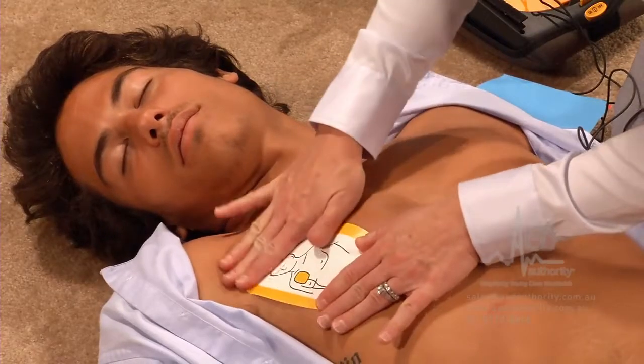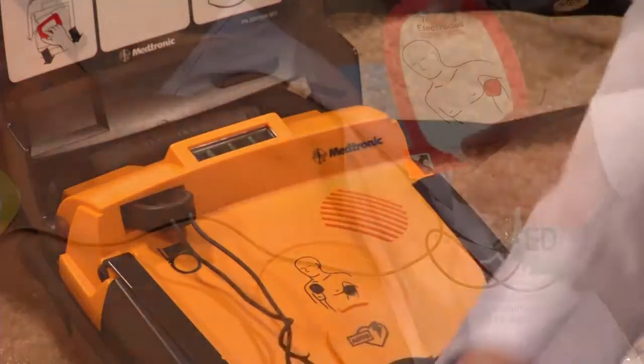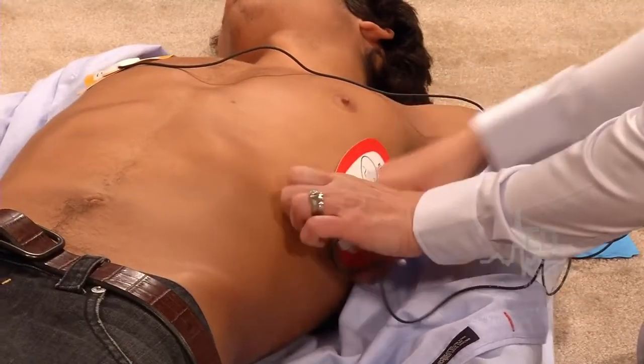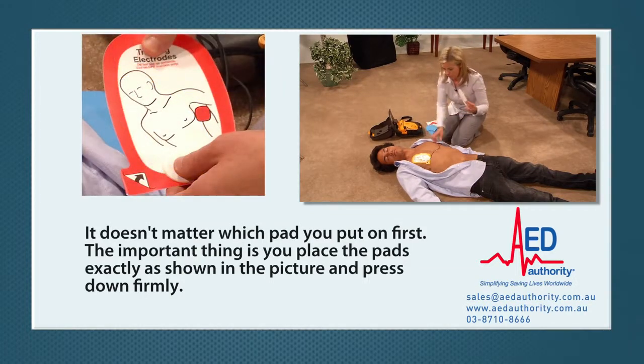Press the pad firmly. Peel the other pad off the blue plastic and apply it to bare skin, exactly as shown in the picture. Press that pad firmly as well. It doesn't matter which pad you put on first — the important thing is that you place the pads exactly as shown in the picture and press down firmly.